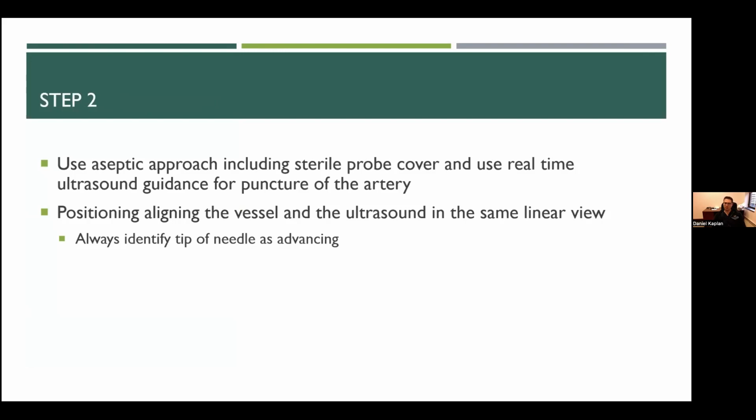So similar approach to your central line, you always want to do everything sterilely, and you always want to use real-time guidance of your ultrasound to visualize puncture of the artery and the needle inside the artery. Positioning, like we spoke about last time, is important. So you always want to position yourself in line with the patient, in line with the ultrasound, so that you're not looking over your shoulder while trying to work in your field. It's often more successful to have everything in a nice straight line.